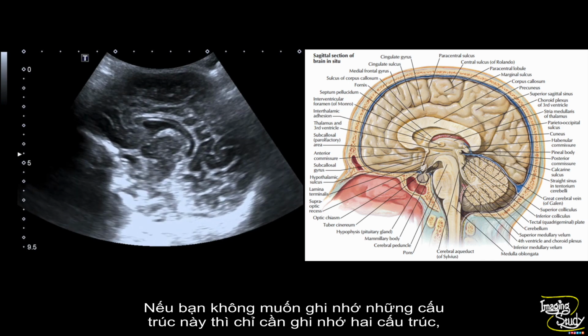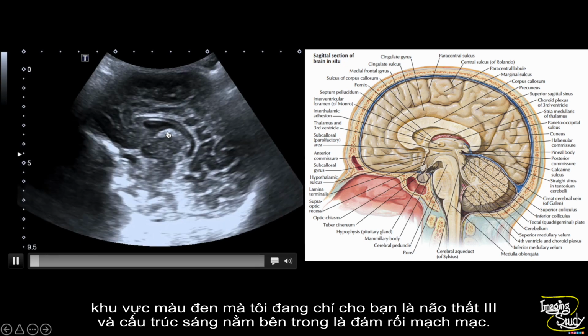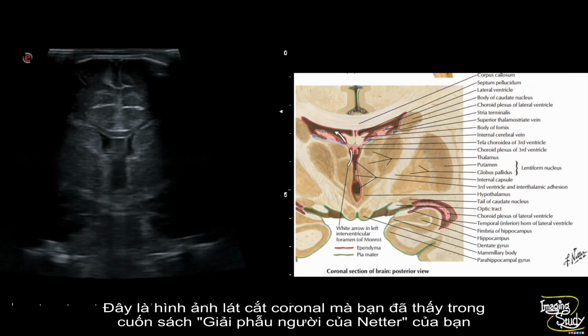If you don't want to remember these things, just remember two things. The black area that I will show you is the ventricle, and the bright area within the ventricle is the choroid plexus. Here is the coronal section image that you have seen in your Netter Anatomy book, and the same image on the left side.